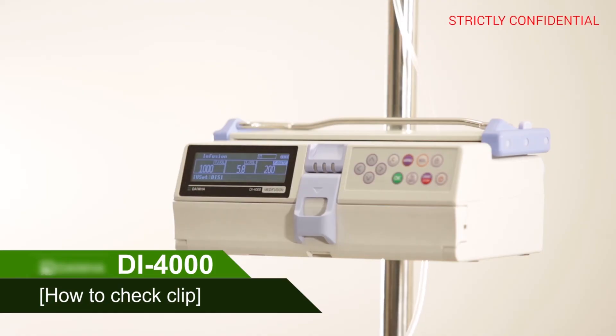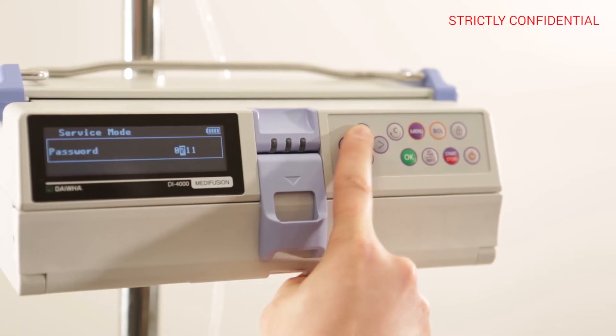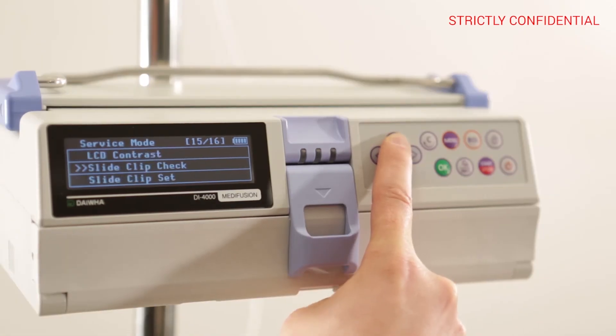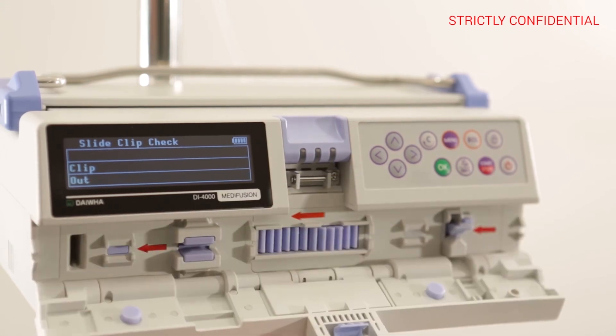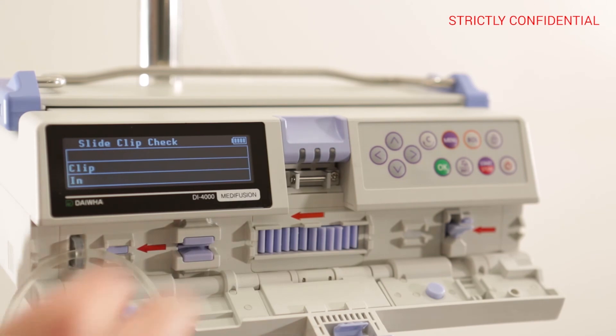How to check the clip: press the menu button and enter service mode, inputting 1711 as the password. Use the arrow keys to enter the slide clip check menu. Install the clip and check if 'OUT' is displayed when removed and 'IN' is displayed when installed.